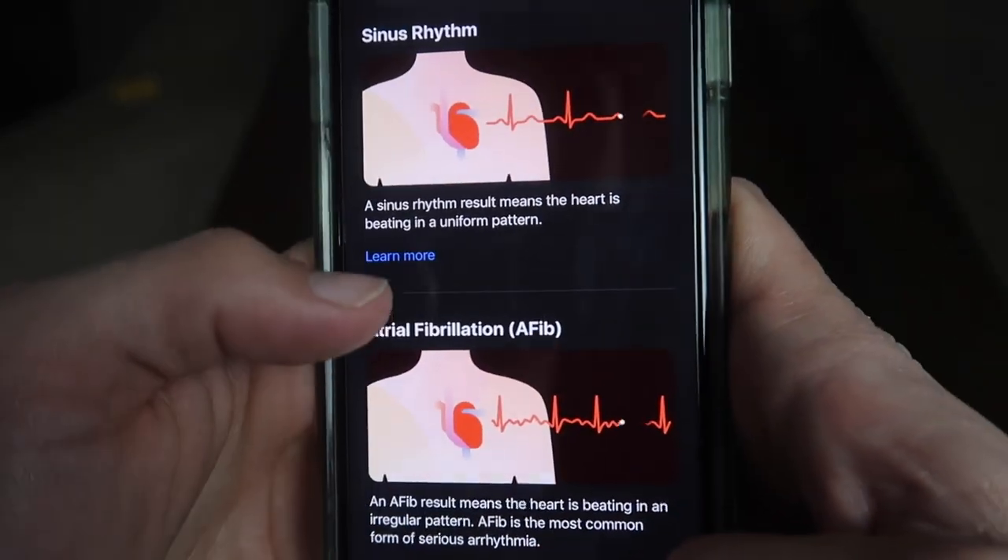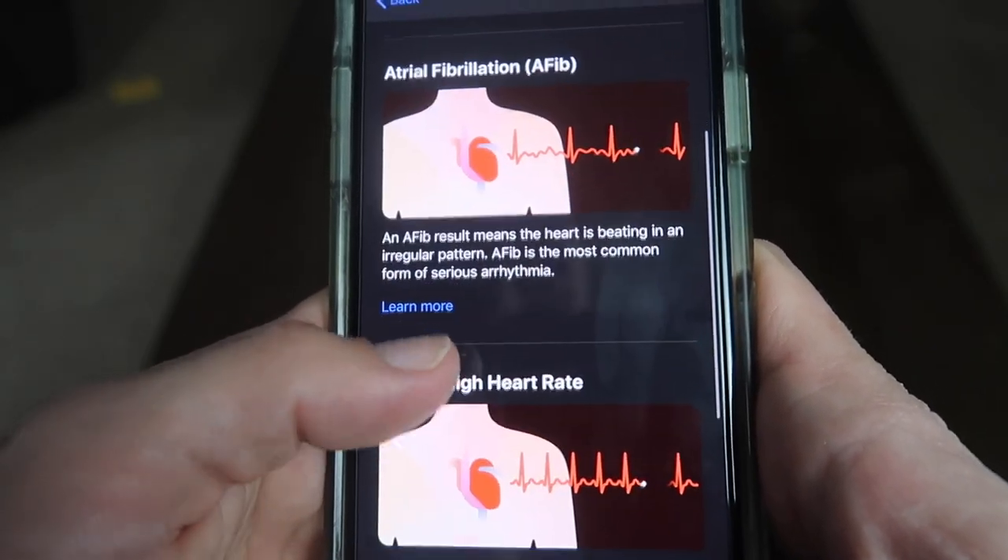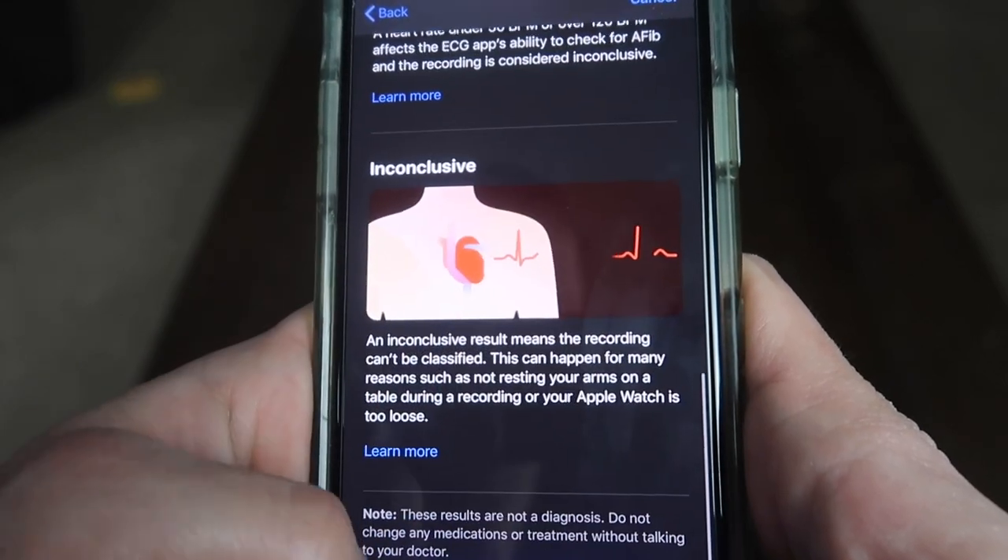Hopefully I don't have to go to the hospital today. Sinus rhythm means the heart is beating in a uniform pattern. Other results include afib, low heart rate, high heart rate, or inconclusive.